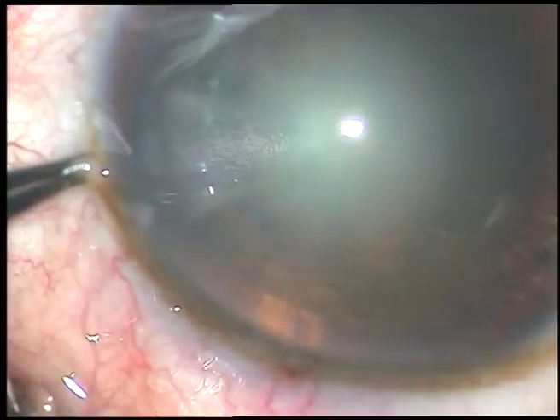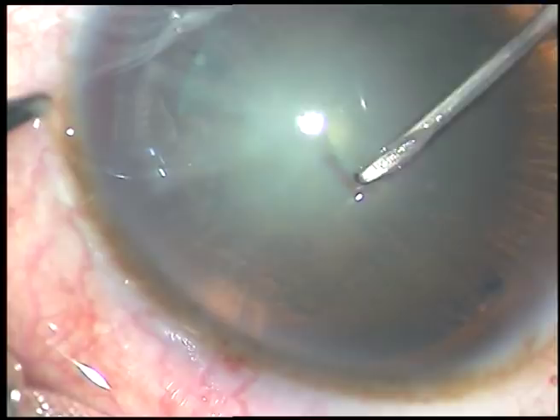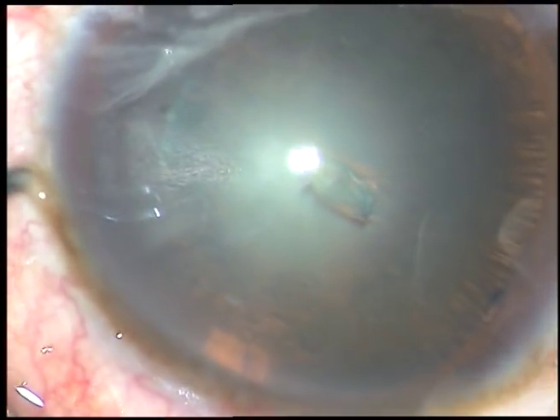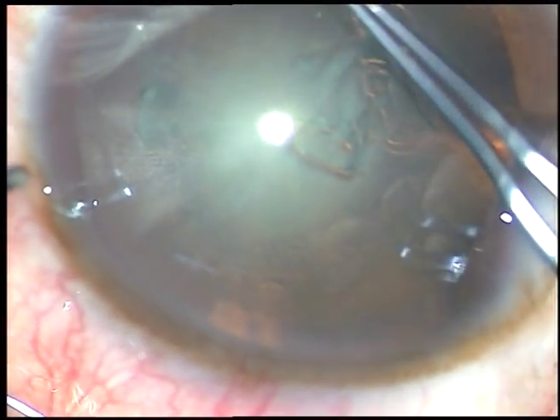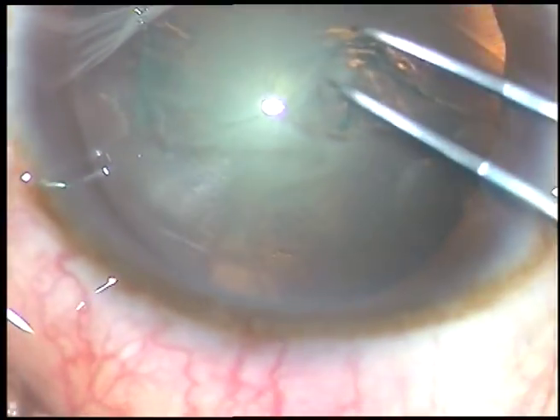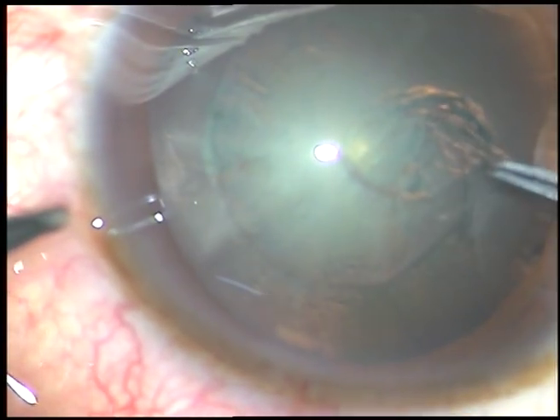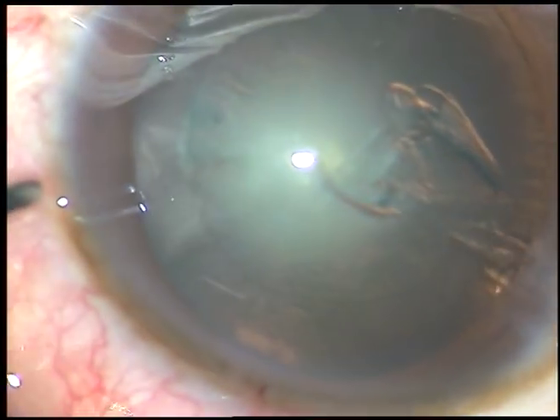Capsulorhexis is to be done. I am taking help of a 26-gauge bent needle to raise a nice, easy-to-hold capsular tag. I hold this tag with the Utrata forceps and go anticlockwise to do a CCC — continuous curvilinear capsulorhexis. This is a rhexis of about 5 mm size.